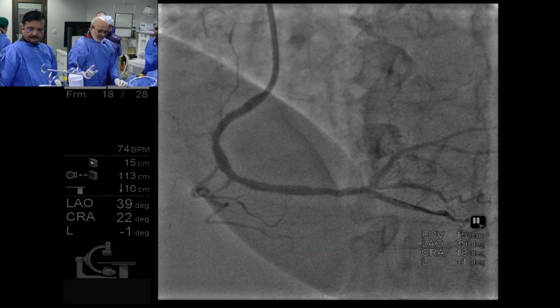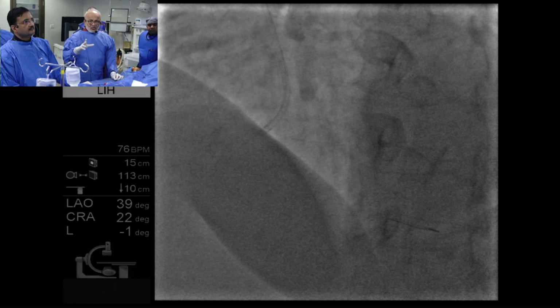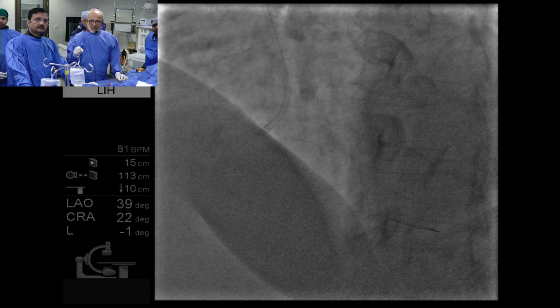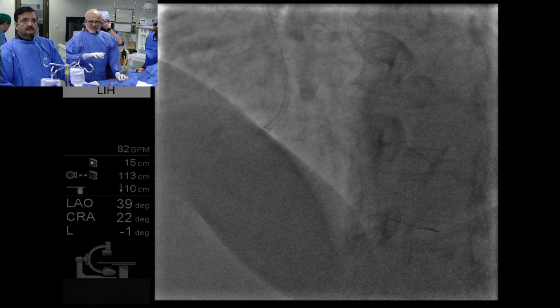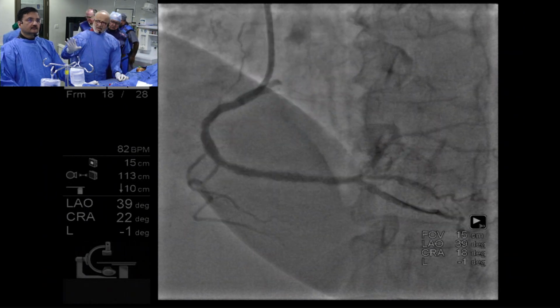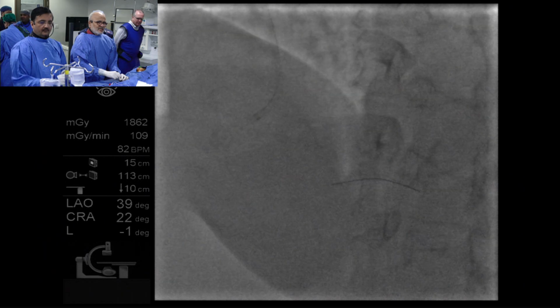So here it is okay. But if I see a big nodule and Rota has not worked without any cracks, because Rota and IVL will show some pulverization at the border. The non-compliant balloon will show the big cracks, like blocks. And IVL will act like a crusader and do a lot of breakage over there. Here, I think it is a good idea. Non-compliant balloon, we have to dilate afterwards, but we should be able to give a good MSA for sure.